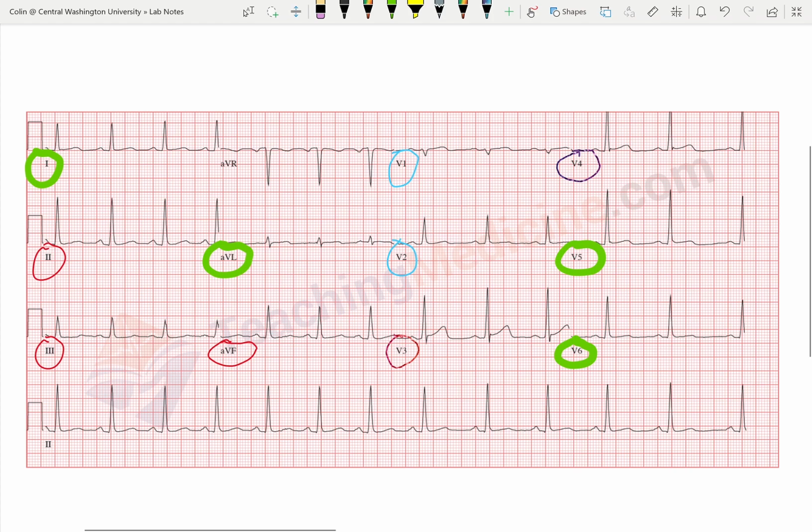So you never just do one 12 lead. You're going to do multiple 12 leads. It's no different than as a good EMT, you're constantly rechecking vitals, right? With sick patients, every 5 minutes. This is the same deal. We're going to take 12 leads as needed, and the machine's really smart too. If it notices a big change, it'll actually spit out a 12 lead at us. So if we ever look up and the machine's printing something out, it may have noticed something before we did.